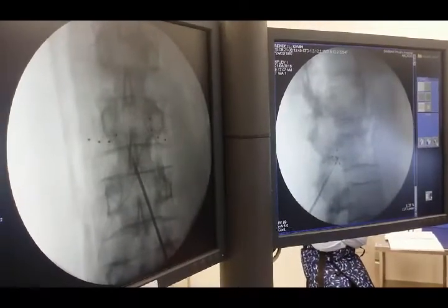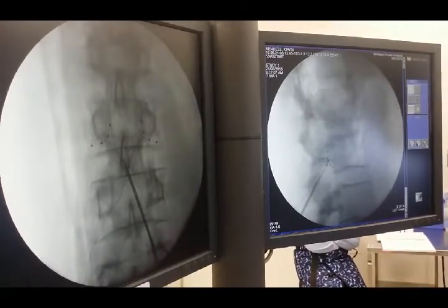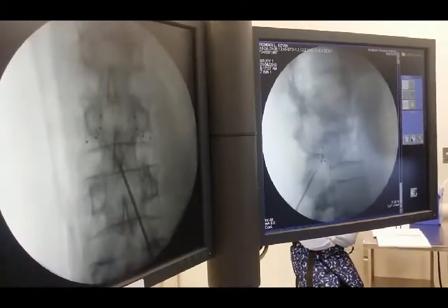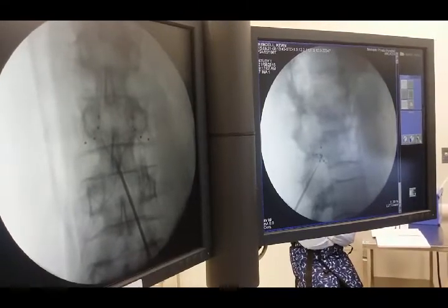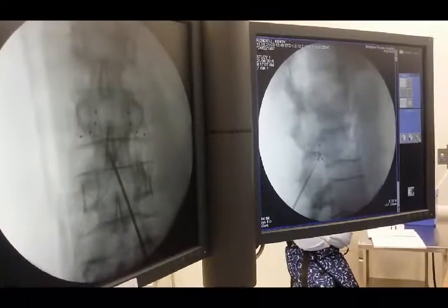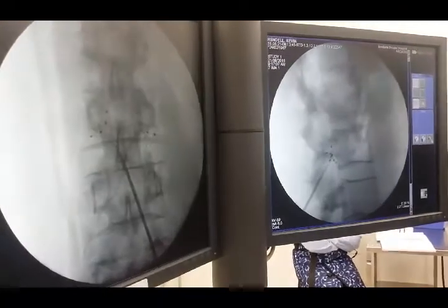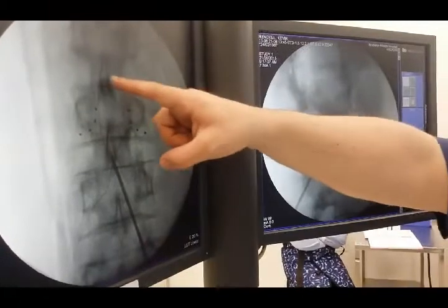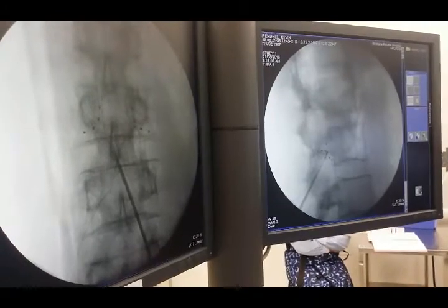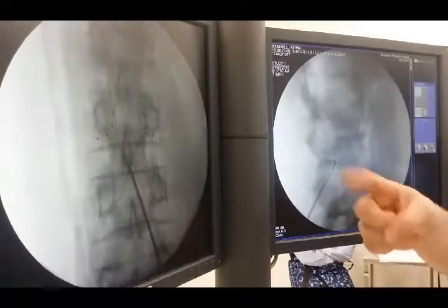Pull your sheath back a little bit more. I'm putting the sheath back - I don't want that to be dragged. See our stilette - if it's only there, it's going to be pushing up the top loop. You might need to bring it back if you want to put this right out. All that - now I'm just pulling the sheath back. Just try and turn everything and push some more to try and get this down with a loop.